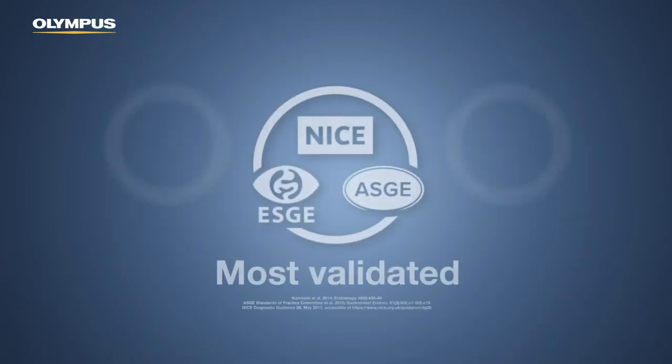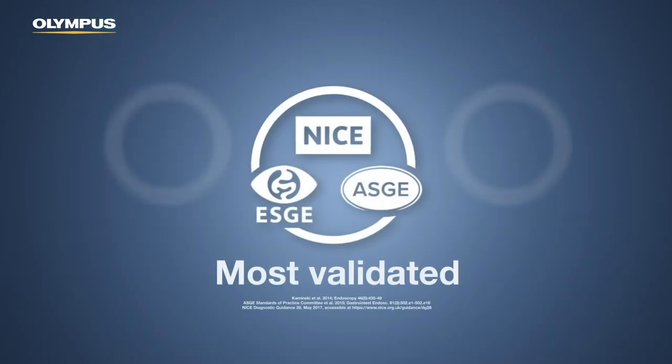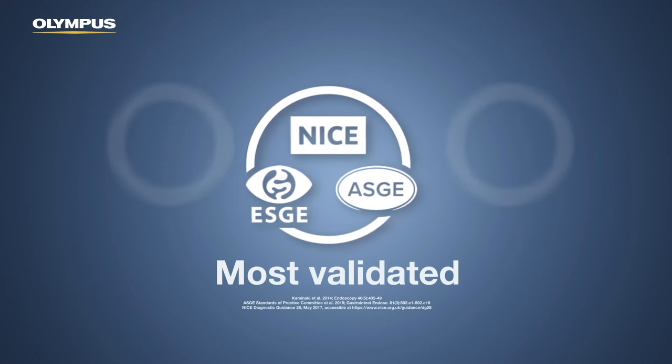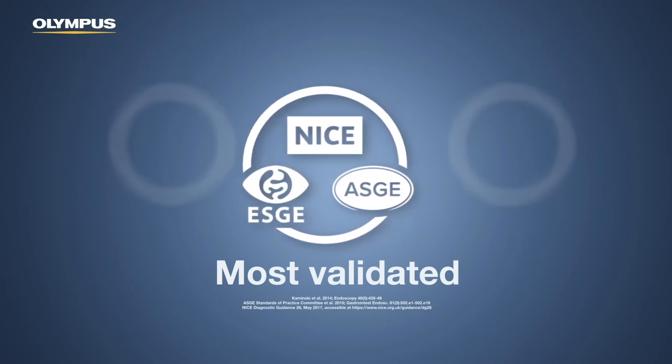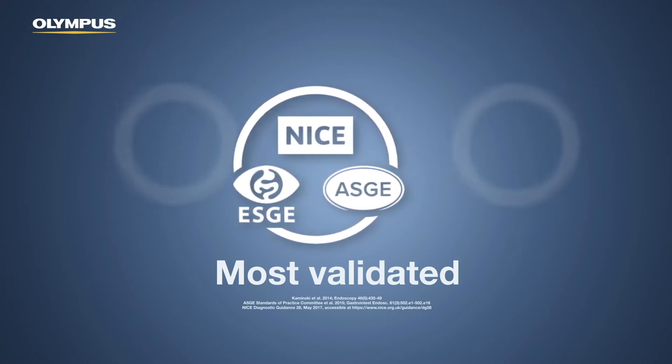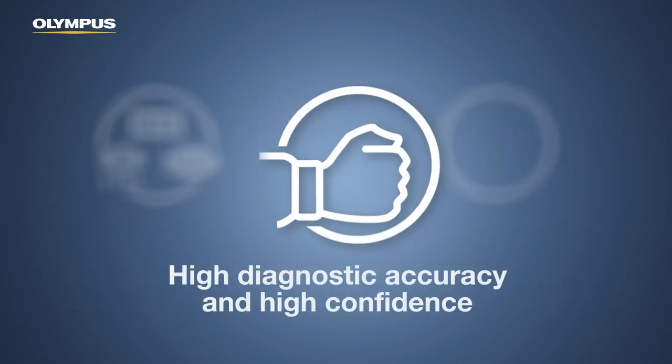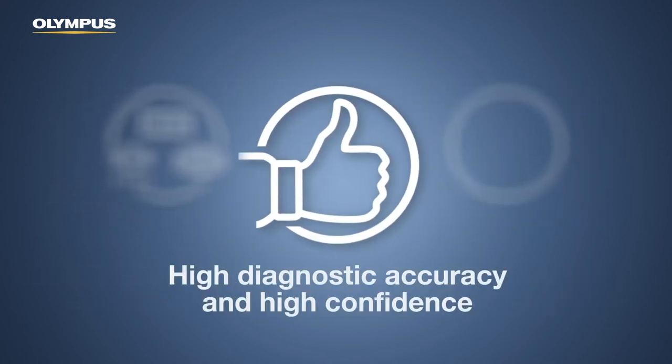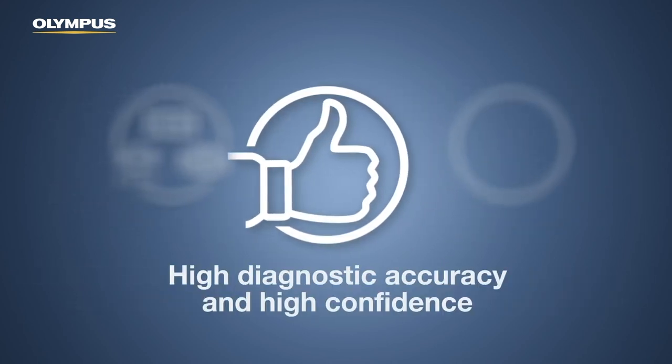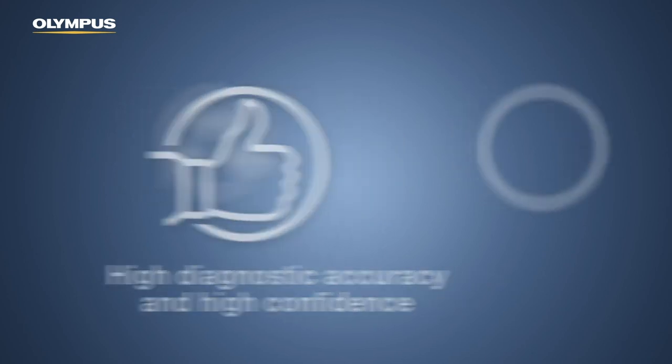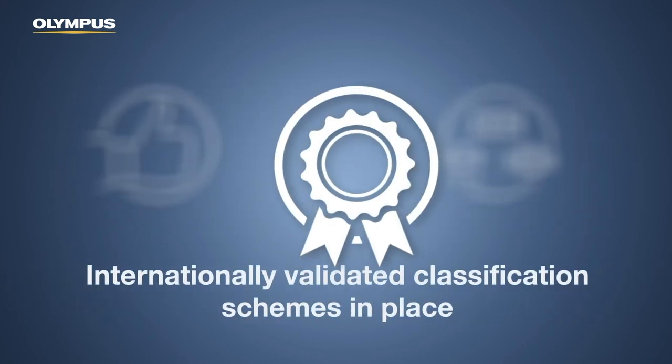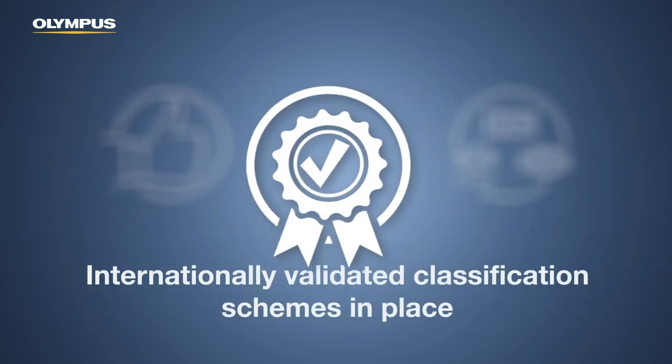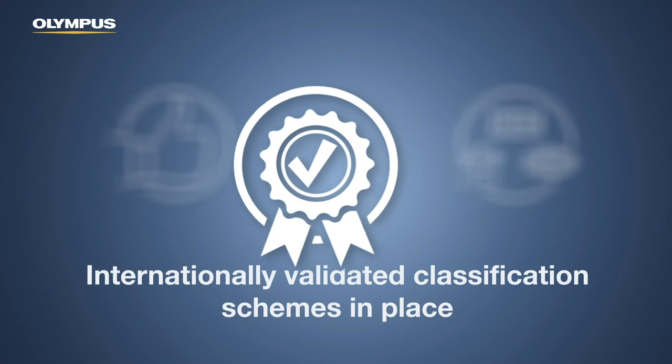NBI is the most validated and society-endorsed imaging modality for optical assessment of lesions. It supports high diagnostic accuracy and high confidence in diagnostic decisions, and it has internationally validated classification schemes in place.